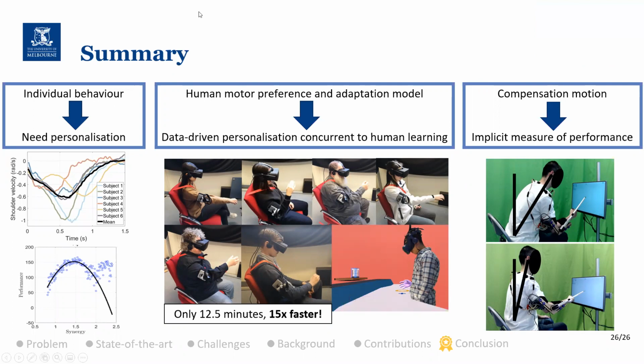Yeah, thanks, Ricardo. I just had a question about the time scale separation that usually is in place for extremum seeking type approaches to work. Usually the process is meant to be the faster time scale, right? So it reaches a steady state, and then you do the updates with the extremum seeking. So it's not clear here how much of a timescale separation there is, given that you're repeating the task. Can you shed any light on how that works here? I guess the learning would be slow, I'd imagine, right? The human's loop is not fast.